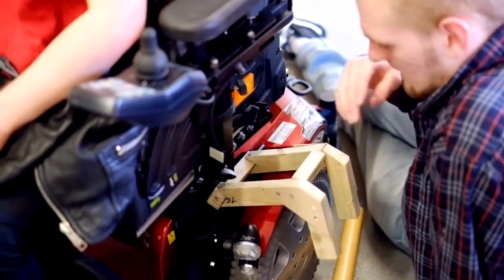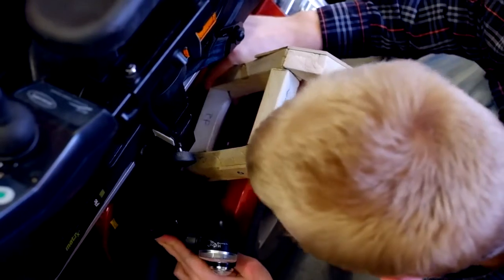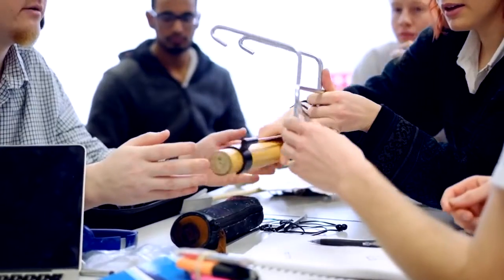So we decided to go with something that would fold up into the wheelchair and then be able to fold it out when she needed it, and block the door so that it can rest on that — resting on her wheelchair so she can get a block when she goes through it. With James' prototype in mind, we worked to bring it to the final product stage.